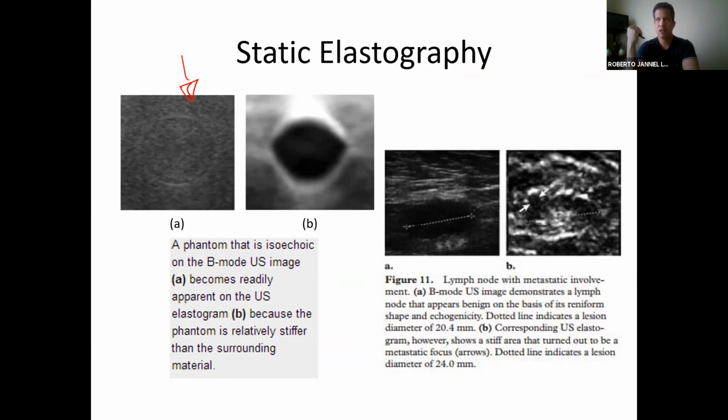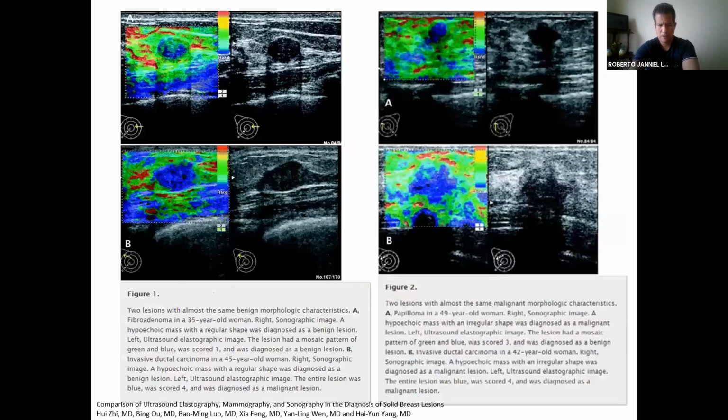So it's very important to monitor the lymphatic system too, looking for things like sentinel lymph nodes and other things that maybe you have discussed in some of your other lectures in other courses. We're not going to focus exactly on that, but it's very important to look into. On the elastography, for example, in here, it's showing you that you can observe certain features in the elastograms that would help you identify a metastasis in the lymph nodes. This again would be breast imaging, right? You can actually see it from the images themselves, right?